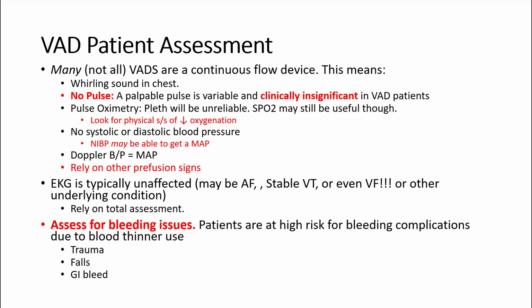The other thing, the very big thing I'll talk about later, is assess for bleeding issues. Because they tend to be hypotensive, because they fall and they're on blood thinners, you're worried about head injury. These patients, because they're on blood thinners, have GI bleed issues. And honestly, these are major reasons, along with stroke, that they're often going to the ED, not for the LVAD. The LVAD is coincidental. We need to be worried about it. We need to be cognizant of it. But often the LVAD or the total artificial heart is completely secondary to the emergency.